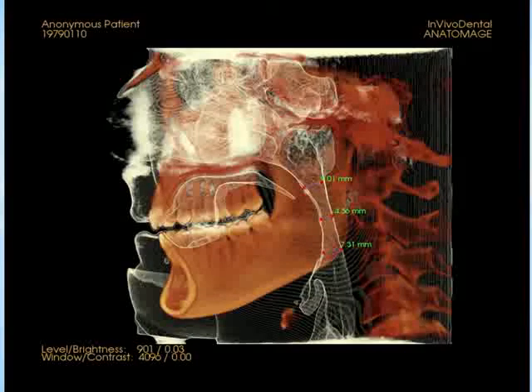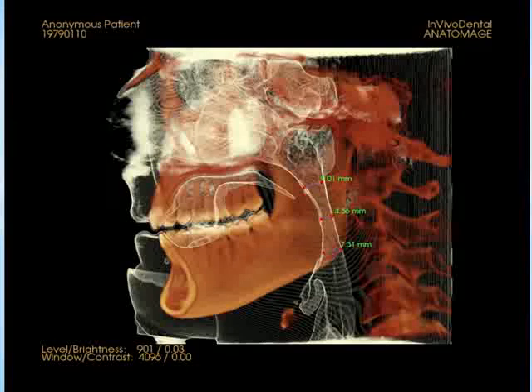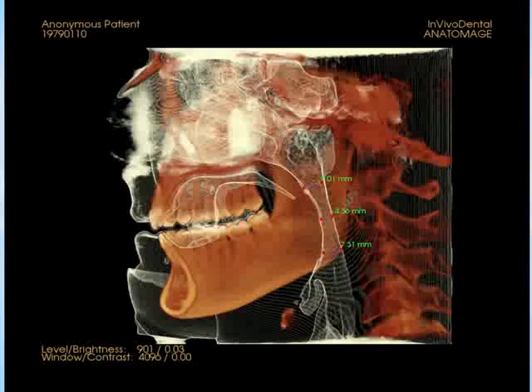One thing I do want to address, which we just breezed over, and I think it's worth coming back to, is you do need to evaluate whether the patients can breathe through their nose or not, one way or another. I do use the rhinometer. I like that because I don't have to look in their nose, and it gives me an idea of what's going on in their nasal airway. But whether you use the speculums or whether you just tell them to breathe through their nose and ask them if they have questions, it is a positive predictor of treatment or a negative predictor of treatment whether they have nasal obstruction. And it also makes for good referrals if networking with your ENT.